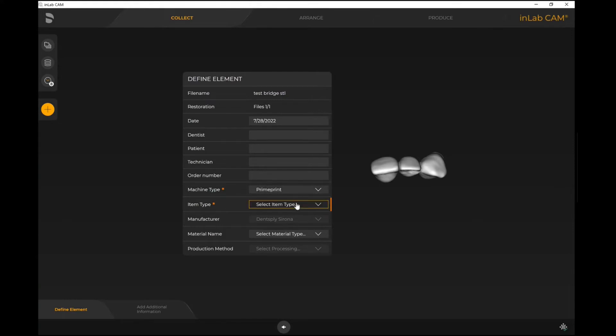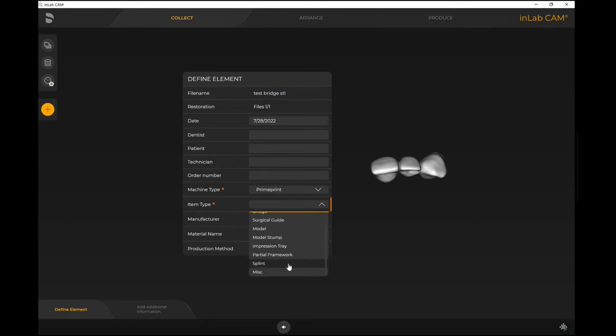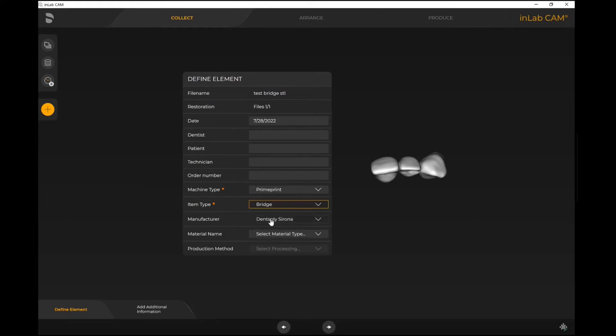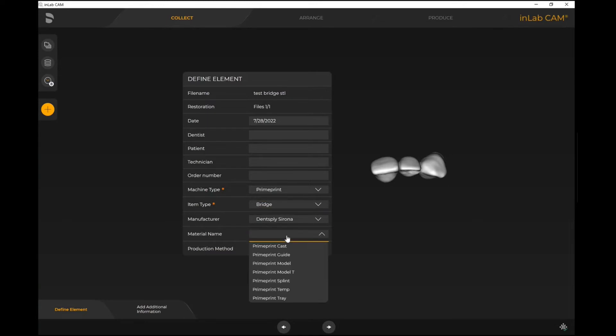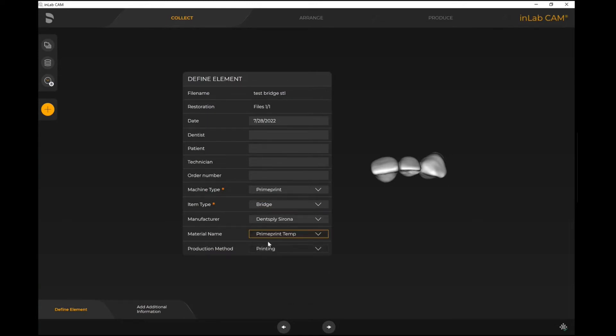If I've got Prime Print selected as my manufacturing method, I can then look at what type of materials I want to work with. If I'm selecting Item Type as a bridge, which this is, the material name I'm able to identify what I would like to utilize. Let's say I'm printing this in the Prime Print Temp material. I can now select Prime Print Temp.